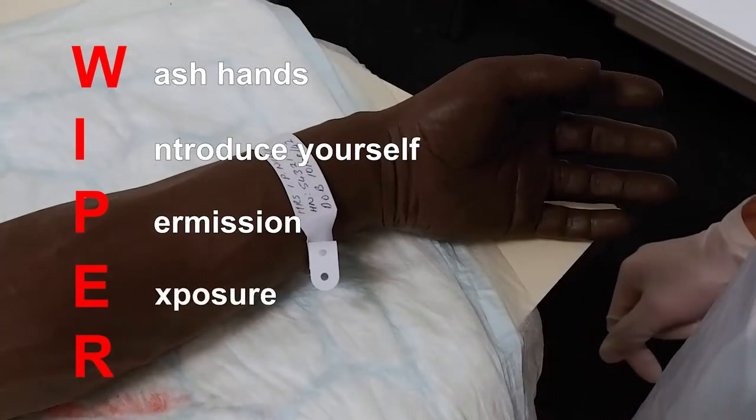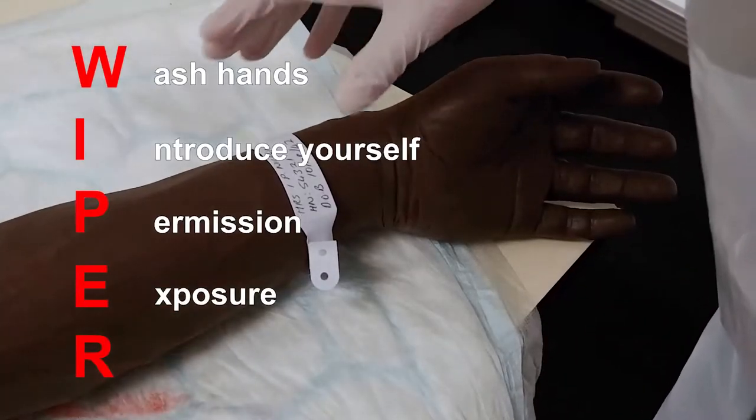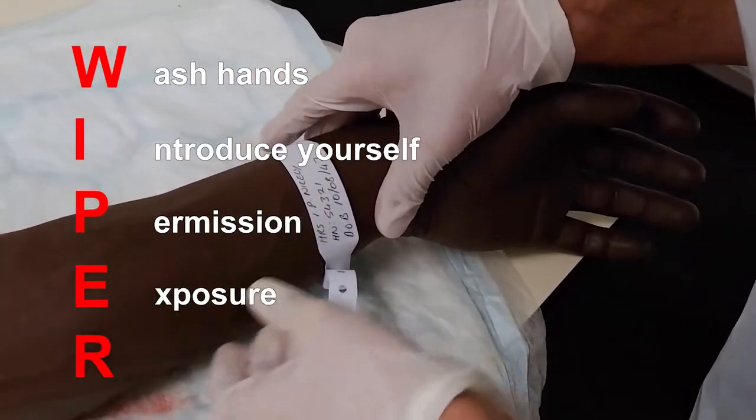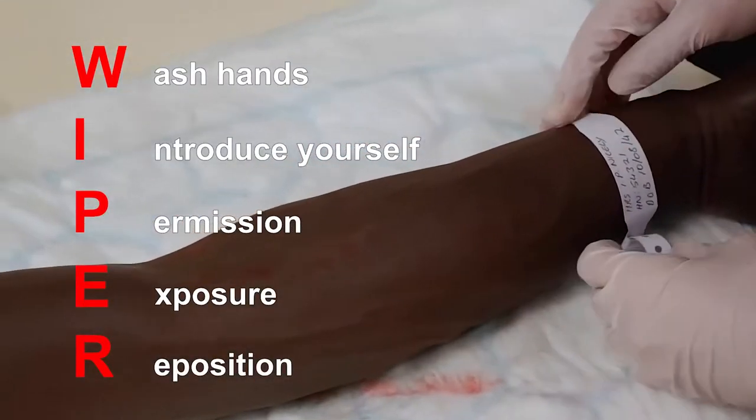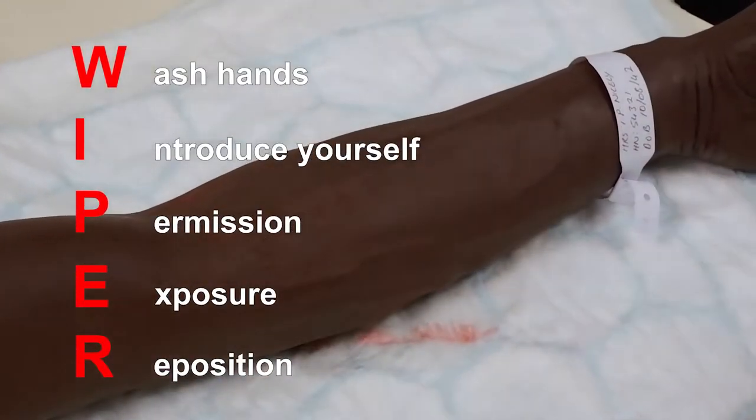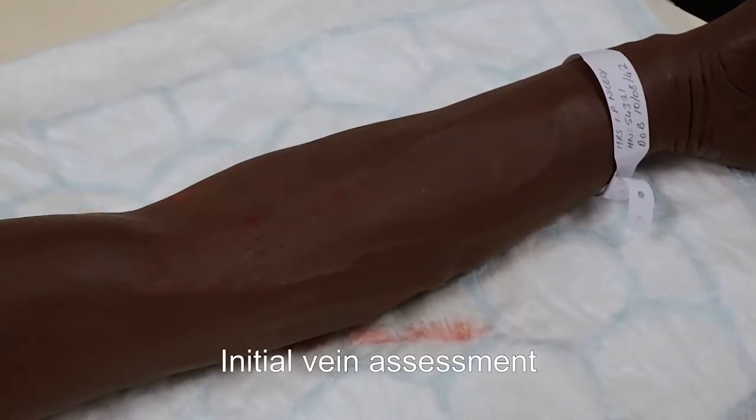Expose both arms and choose a suitable site to take blood from a vein. Reposition the patient whilst ensuring that the arm is fully supported and comfortable. At this stage, you may wish to do an initial vein check by applying the tourniquet and assessing for veins.